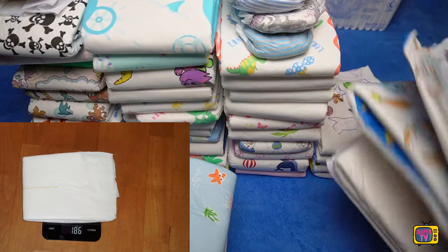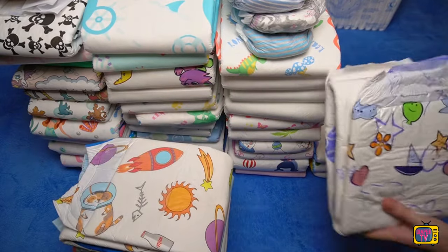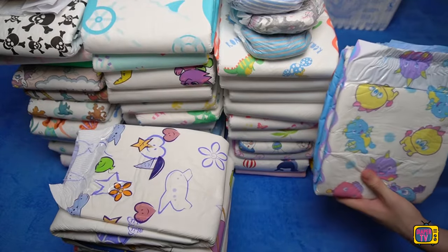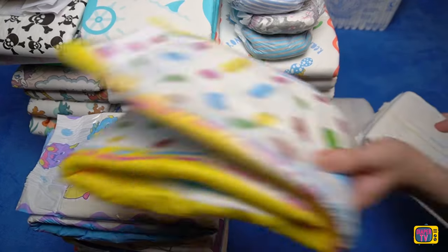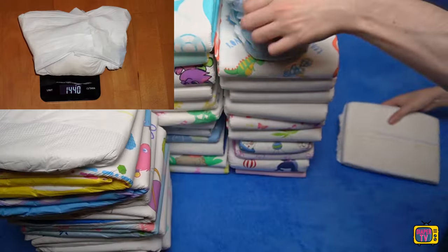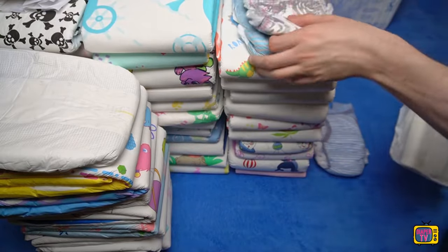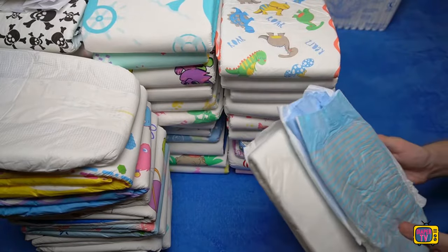Even entry-level products like Crinkles feel a little thicker, so I didn't have particularly high expectations of the capacity. It was possible to wet it several times, but at just under 1.5 kilograms it couldn't take any more and leaked. Anyone who is used to ABDL diapers will laugh at this — by their standards, 1.5 kilograms would be one of the worst results. Many of them are thicker and can withstand much more, although the Supreme Briefs are aimed at moderate to severe incontinence according to the description.